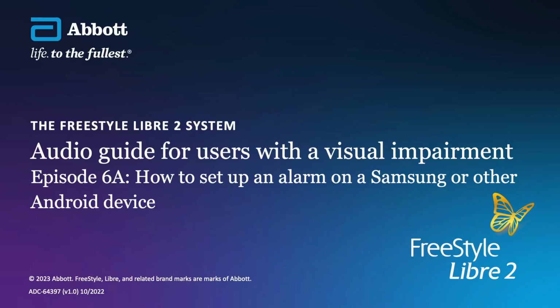How to set up alarms on a Samsung or other Android device. In order to use alarms on your phone, Bluetooth must be switched on before starting your sensor. Your phone must then be kept within 20 feet of you and unobstructed in order to maintain contact with the sensor.